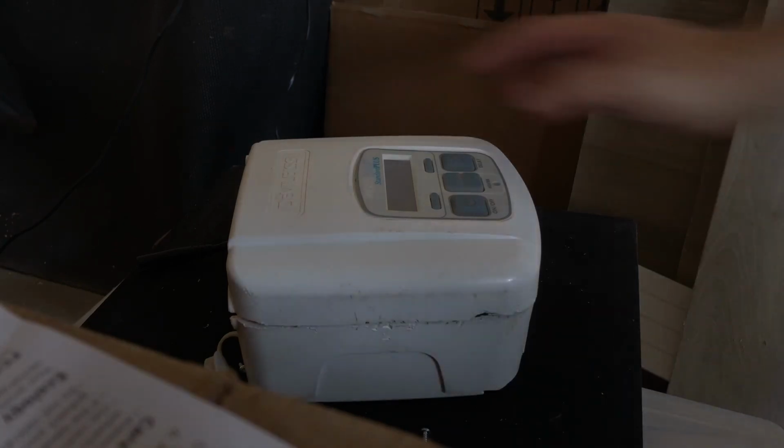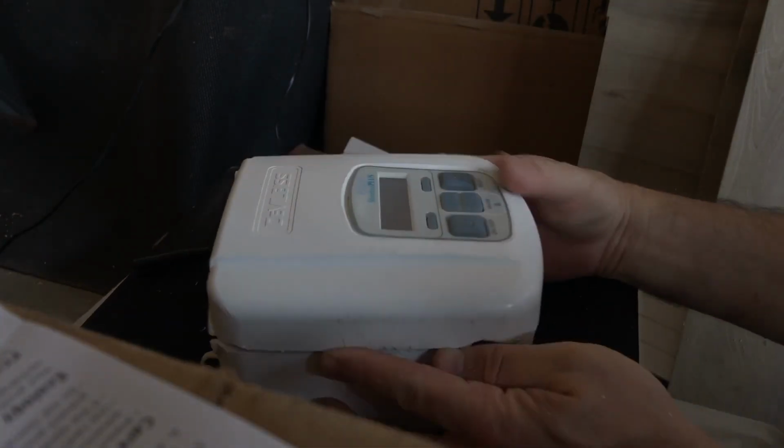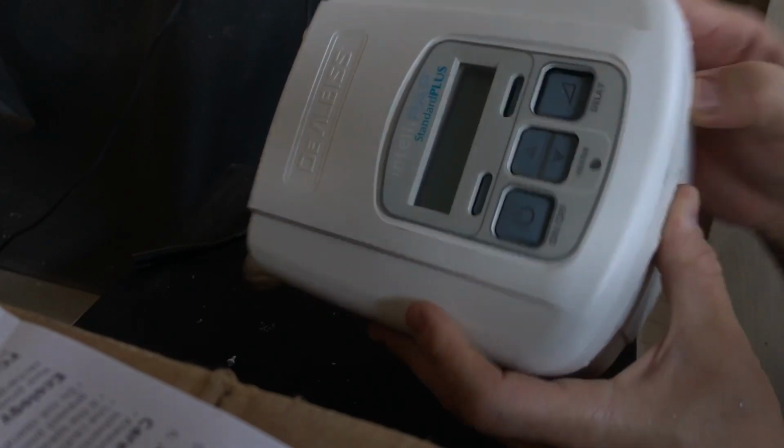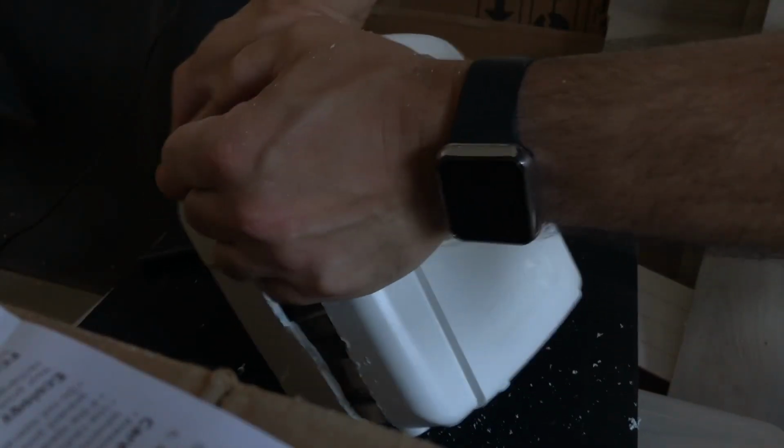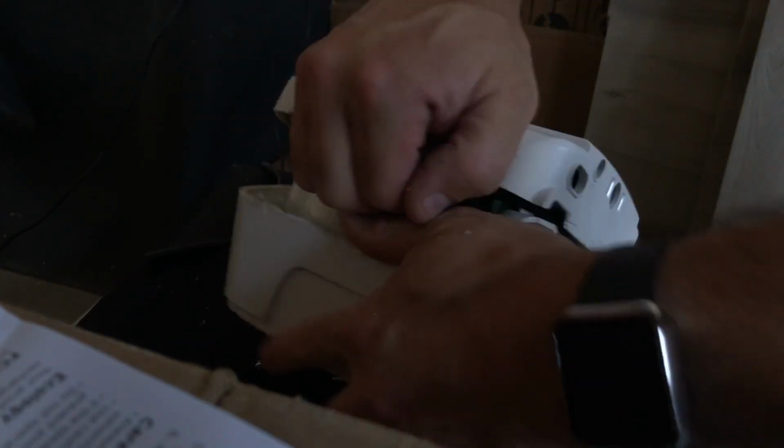Okay, guys, I'm back from quite a grueling teardown. I had to saw this thing open, as you can see here. There's no way I could get those screws out, so there might be a little damage on the inside here, but hopefully nothing too major. Okay, so let's try to pry this last little bit of this thing apart here. I may have to do more cutting. I don't know what's holding it together, but it's really hanging on.